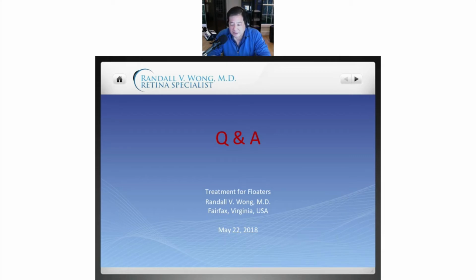I don't know that I've really ever believed that any patient can tell how close or far the floaters are from the surface of the retina based on characteristics. I think that has something to do with some of the guys that perform the YAG saying, I can't do this because it's too close to the retina. I'm not sure if that's valid.